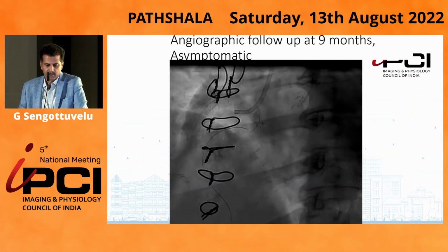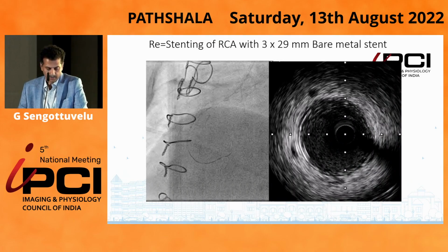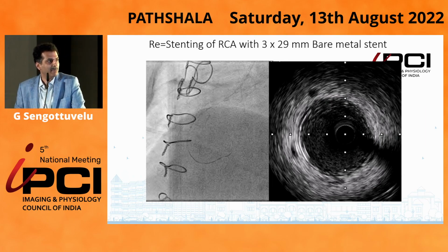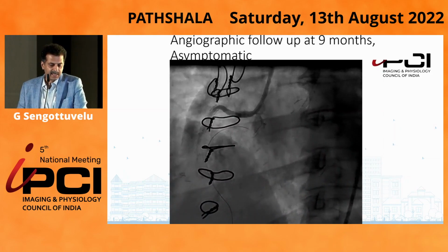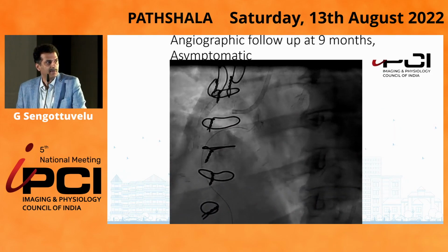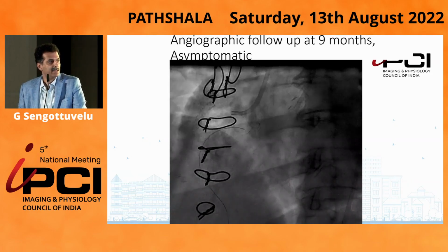And this was the angiographic result after we stented. And I think, okay, we got a good angiographic result. So then this time, fortunately, after 6 months, we were waiting whether the patient would come back, but she didn't come back. We called her after 9 months and said, maybe let's do a check angiogram to see what's happening. So we did a check angiogram, and we found a quite patent stent, and we were very happy. But then we wanted to do an OCT to see what had really happened.